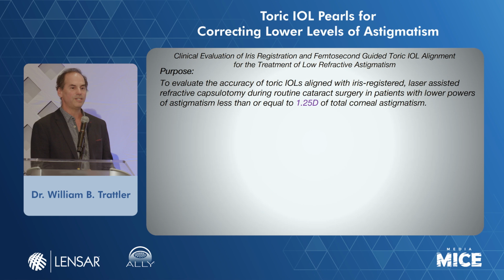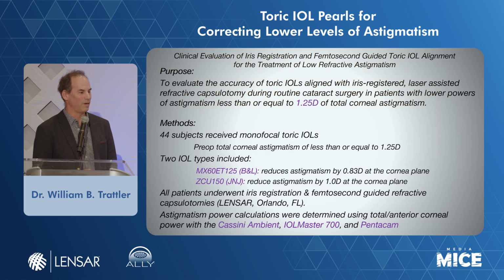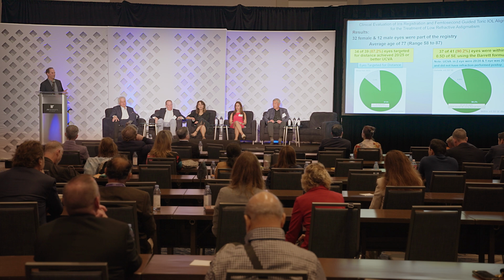So we decided to look at our patients. It was kind of a retrospective study. It kind of made it into a registry, but looking at combining the low power toric lenses with iris registration and femto laser, which is why we're all here. We looked at 2 different types of lenses. We had 32 female and 12 male eyes that were part of the registry.